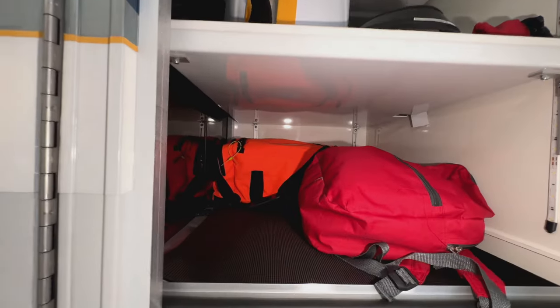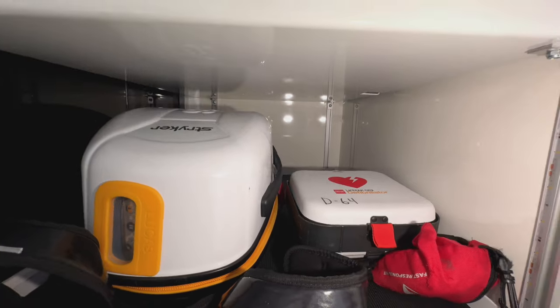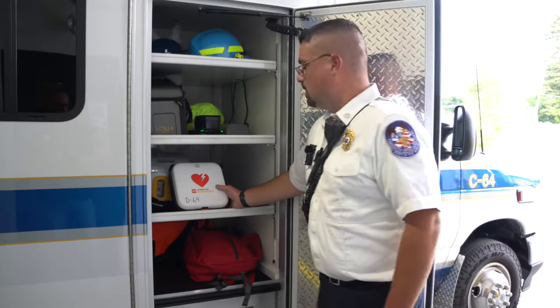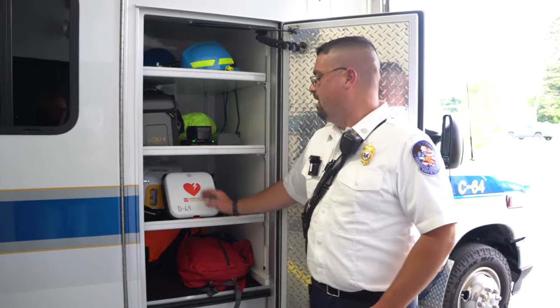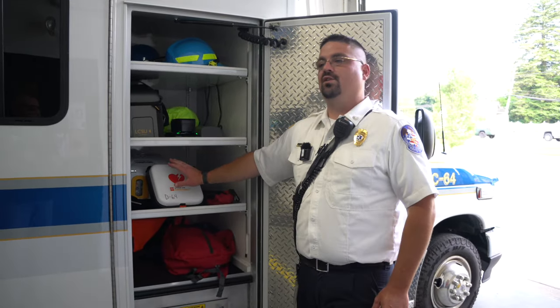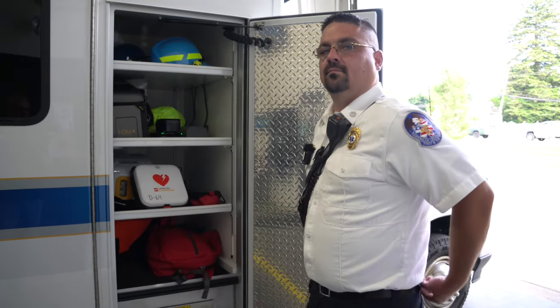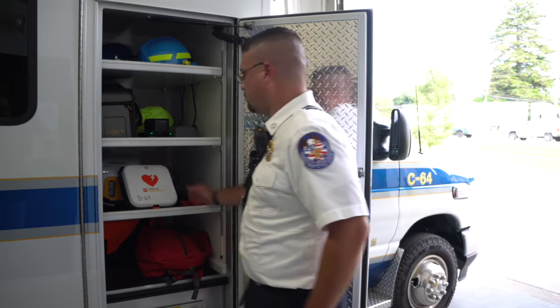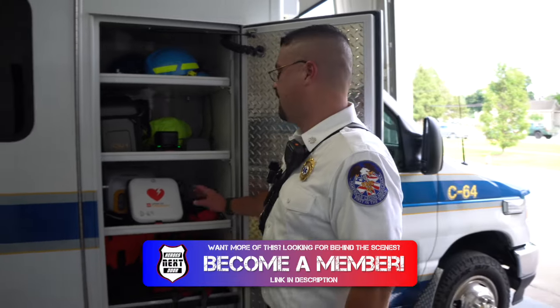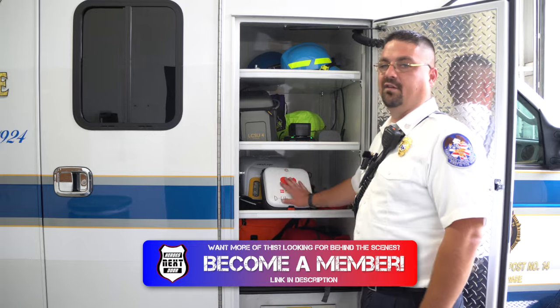This compartment holds our CPR stuff — our AED, suction unit, and Lucas device. The AED is an automatic defibrillator: if somebody's heart stops and it's in a shockable rhythm, it delivers a shock to reset the heart. When you put it on the patient while doing CPR, it analyzes the rhythm, and if it senses a shockable rhythm, it advises you and you can deliver the shock.